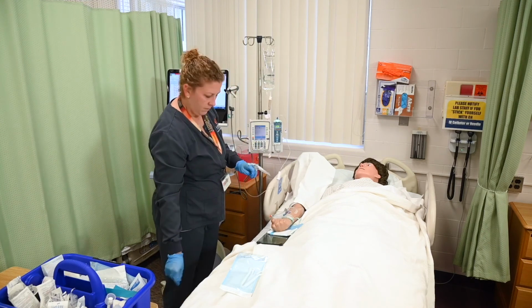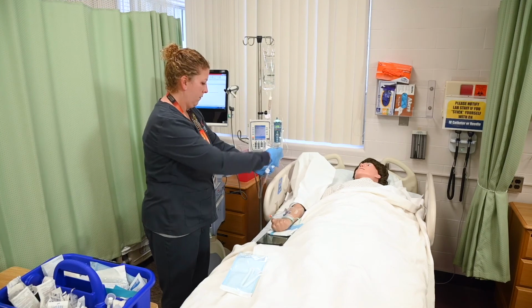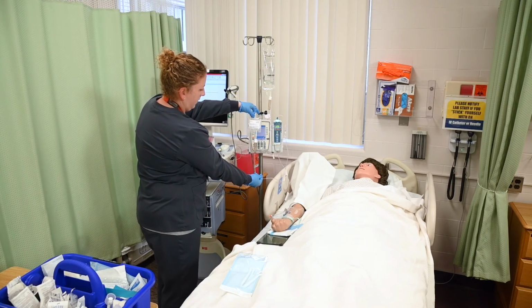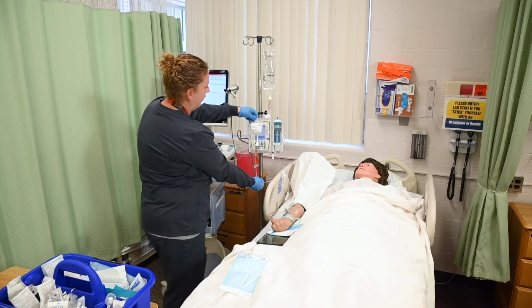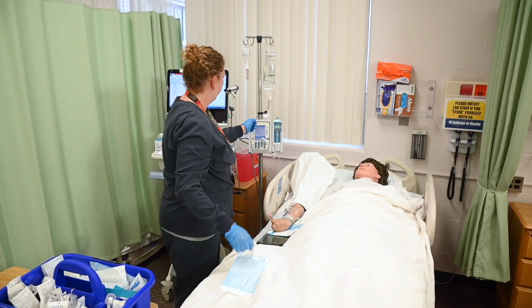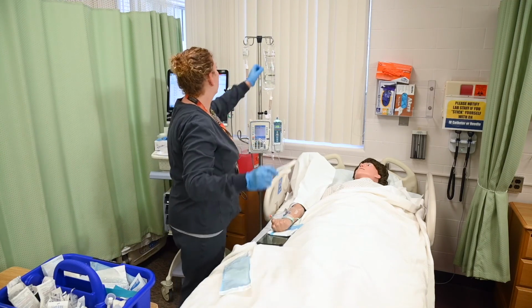Back prime the secondary tubing utilizing aseptic technique until the drip chamber is half full. Try not to lose any of the medication. The chamber's half full. I'm just going to lift my medication up. Close the roller clamp on the secondary line and hang the IV Piggyback on the IV pole.